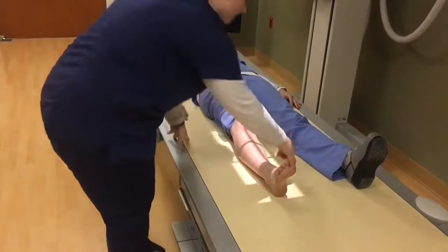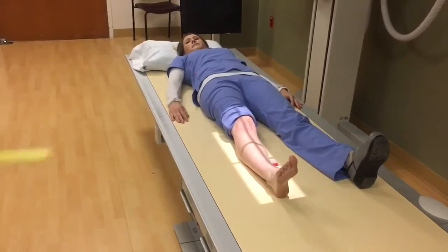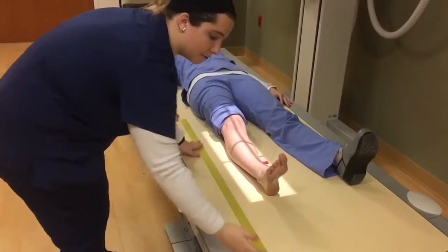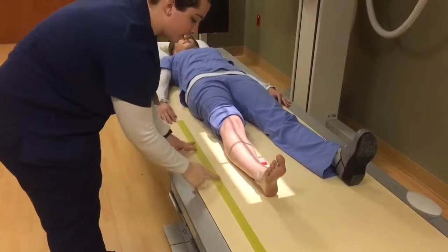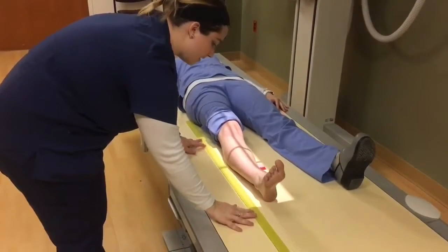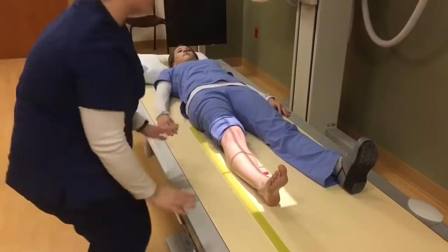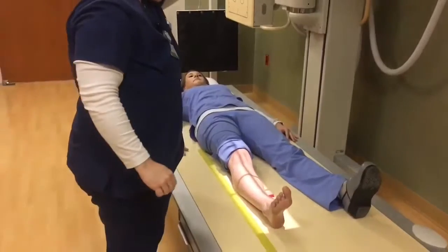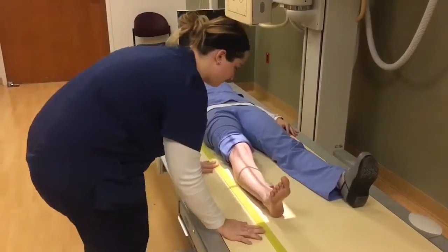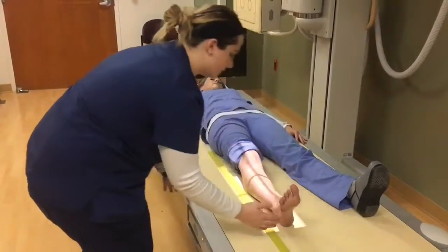I want to put my right marker in, and for stitching, we use a ruler, and this is how the computer is able to line up the images. It doesn't matter if you include one end of the ruler, it'll just read the dots on the ruler to line it up. We should slide it in so that it's not in the anatomy of interest, as close as we can. And now, we are ready for stitching.